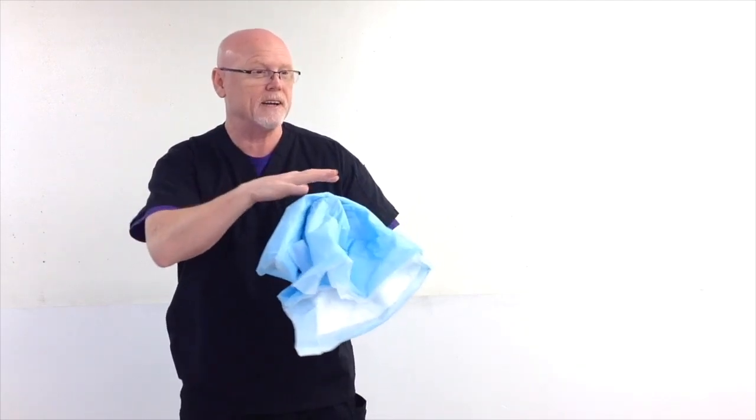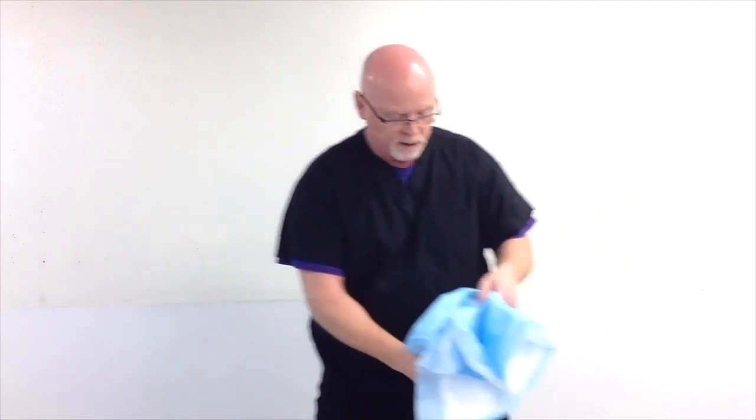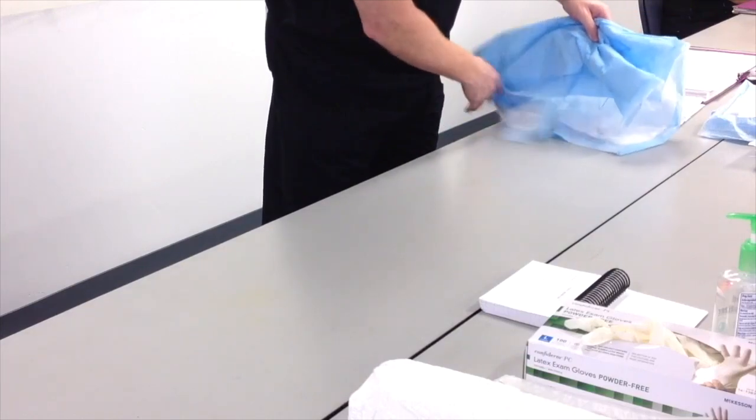So the first thing that I'm going to do after I've shown my CE and they give me the head nod is I'm going to gel my hands. So this is the first process where I've cleaned my hands with this gel that's sitting at the table right here. Okay? Then I'm going to pick the correct mannequin. So I know that there's a vagina under here, so that's why I picked this one. But you'll have to find the correct mannequin and bring it over to the table and set it in the position where you think that you're going to want to set it.